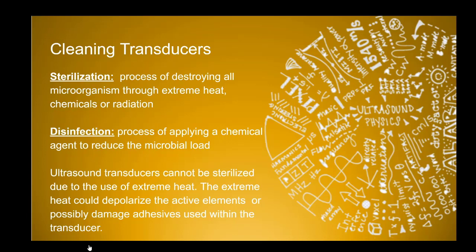So think about when you're scanning and we're done, we have those wipes. You clean off the top of your transducer. That reduces the microorganisms. It does not sterilize it. Now, a lot of the chemical wipes that we use are very good at killing viruses and a lot of infectious microorganisms, but it does not 100% get rid of everything like sterilization does.